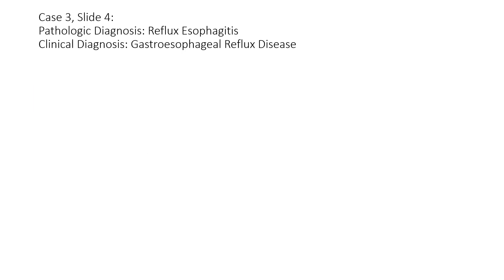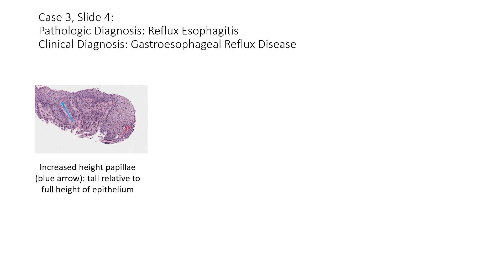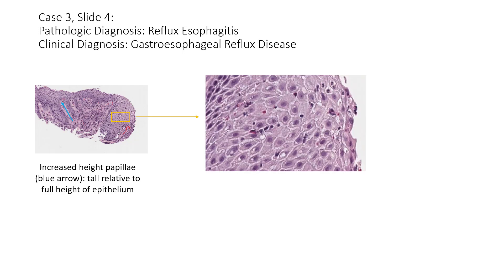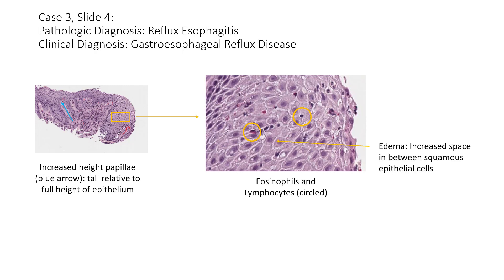Case 3, slide 4 is reflux esophagitis. In the biopsy, you can see the papillae are quite tall relative to the full height of the epithelium — this is called increased height papillae and is a common finding in esophagus being damaged by some agent. This results because the esophagus is attempting to repair itself in response to an insult. On the right, you can see eosinophils and lymphocytes, and there is edema visible as increased space between the squamous epithelial cells. The clinical correlate of pathologic reflux esophagitis is gastroesophageal reflux disease.